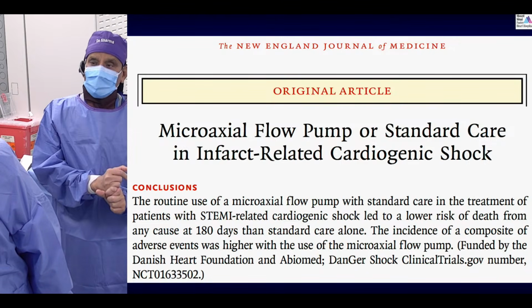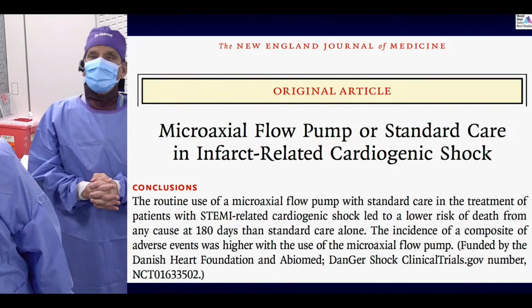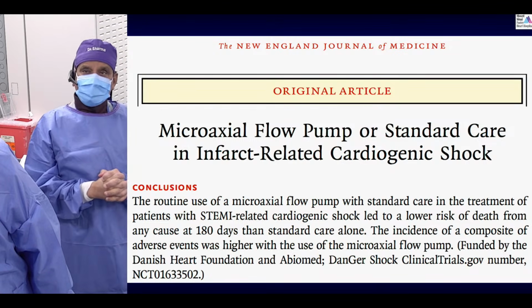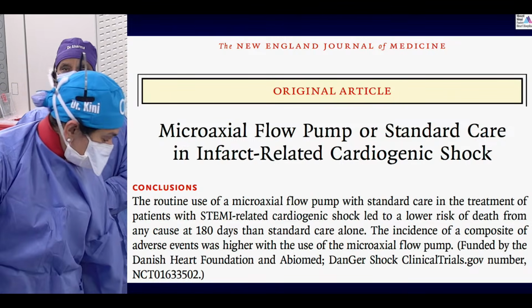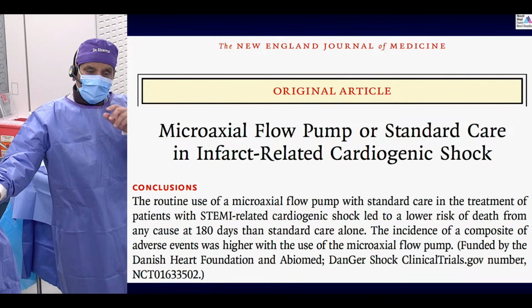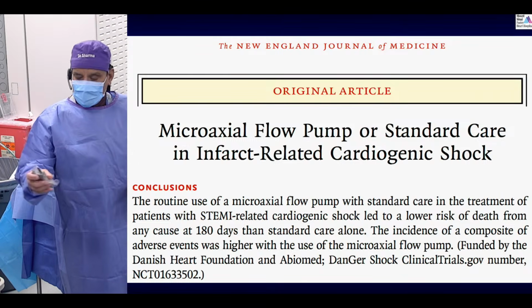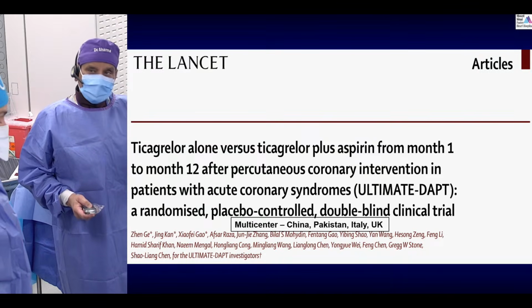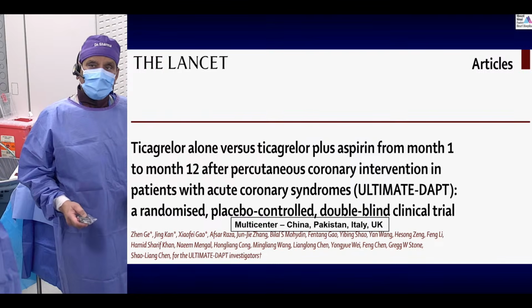Because of the vascular bleeding. So because of the 14 French sheath size. What if we bring it to 9 French and you'll have lower vascular bleeding and lower vascular complications? So this is our next step, as you know, many devices are coming into that line. The Impella group has their 9.5 French. Then we have Magenta Medical, 9.5 French. There is another one, Supira, 9.5 French. So those will change this landscape of mechanical circulatory support devices in our lives, that they are good and associated with good outcome, yes, but at the same time, hopefully will not increase the bleeding and vascular complications.